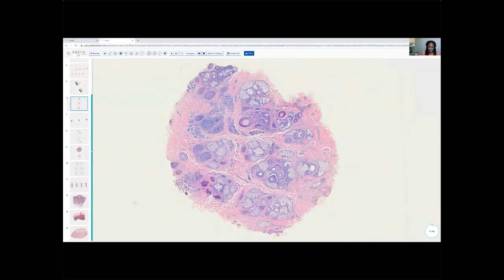Okay, so we've done a pretty good overview, I would say, of both the scarring, a few scarring, but mostly the non-scarring alopecias that are more common for us to see. So just to recap, we talked first about traction alopecia, traction and trichotillomania. Those are both going to be non-scarring. We also spoke about androgenetic alopecia, which for the most part is going to be non-scarring in its earlier and mid phases.